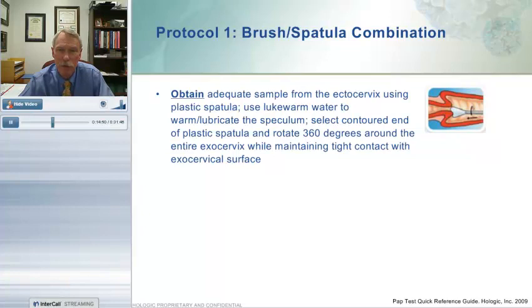The speculum can be introduced using lukewarm water as a lubricant. That never seems to work for me, so I use a water-soluble lubricant that has been appropriately approved by the cytology lab that I use. But I think the important point is to lightly coat the posterior blade of the speculum with the lubricant, and to be sure that there is not an accumulation of lubricant in the bowl of the blade so that it goes against the cervix and you end up sampling the lubricant instead of the patient's cervix.